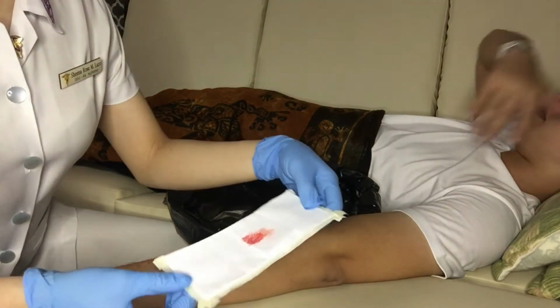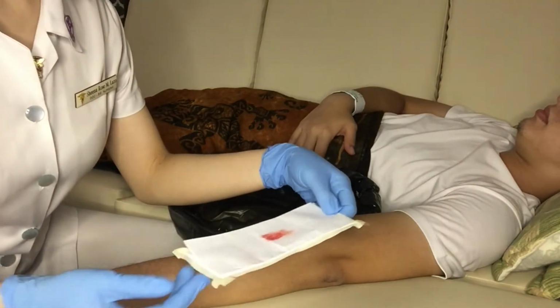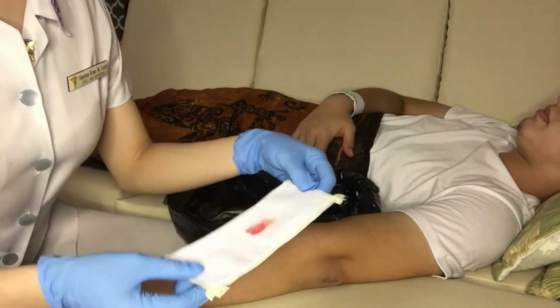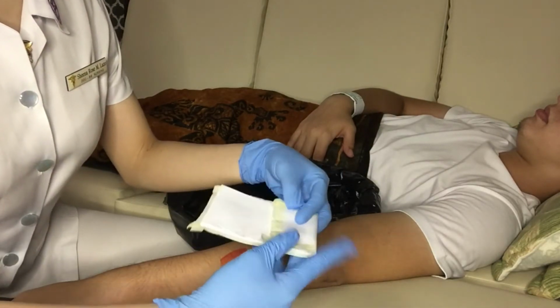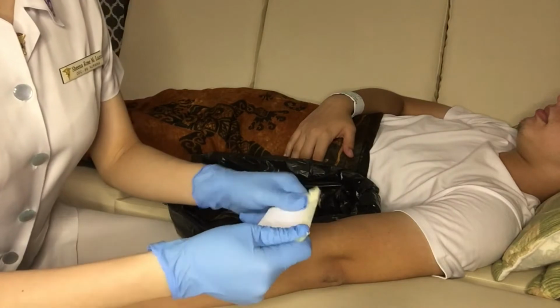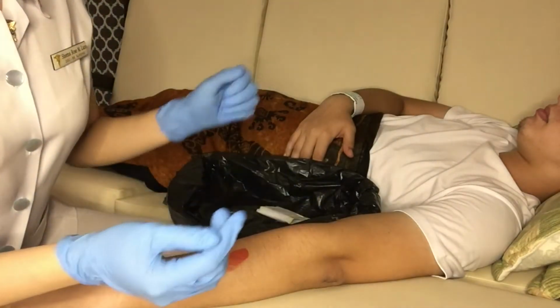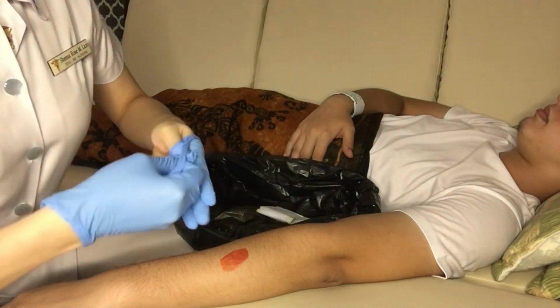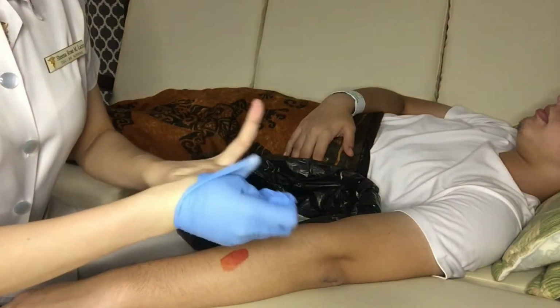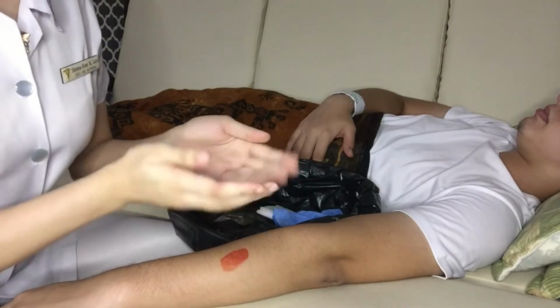After that, you have to assess the dressing. So we have here a slight bleeding from the wound. Then dispose the old dressing properly into the biohazard bag, and remove your old gloves to prevent contamination.